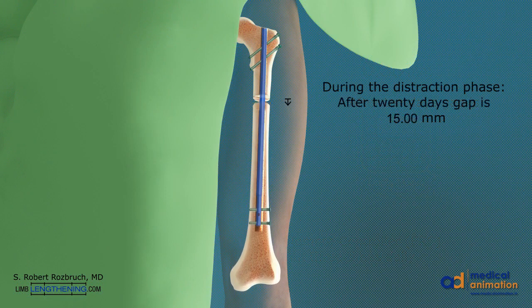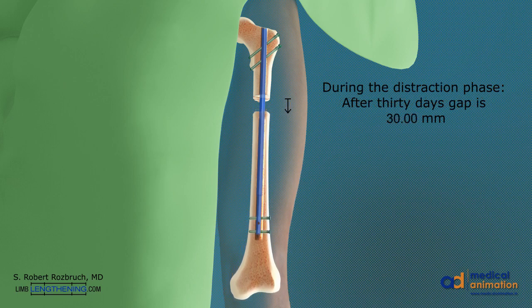After 20 days, there is 20 millimeters of length added. After 30 days, 30 millimeters or one and a quarter inches of length is added. This can be progressed up to eight centimeters as needed.